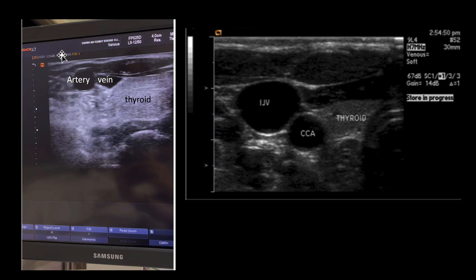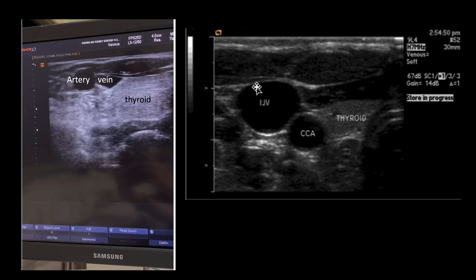So what would happen if you don't do ultrasound — you're probably going to puncture the artery first. Because normally, if it's a posterior approach, you would puncture from here. In a normal patient, you would attempt to cannulate the jugular vein here. But in this patient, the needle would probably hit the carotid artery.